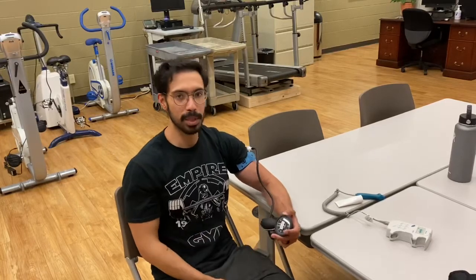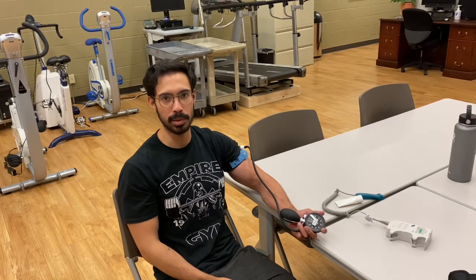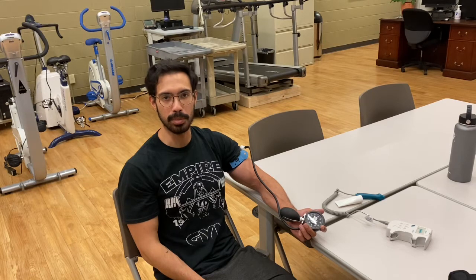Okay, so I'm going to be demonstrating how to determine arterial occlusion pressure, also known as AOP or limb occlusion pressure. And it's important to figure out AOP because it's the only real way that we have to standardize how we're doing blood flow restriction training.